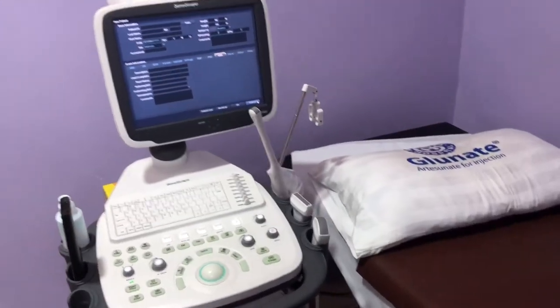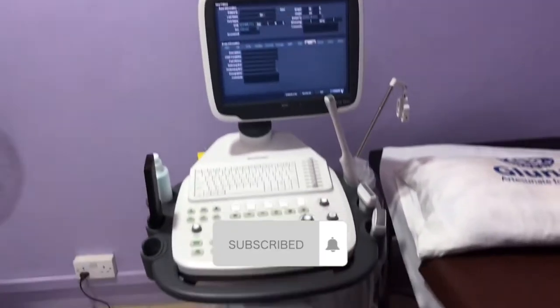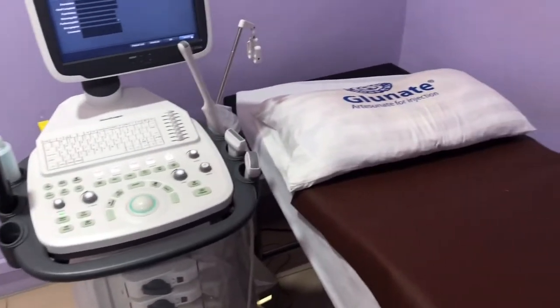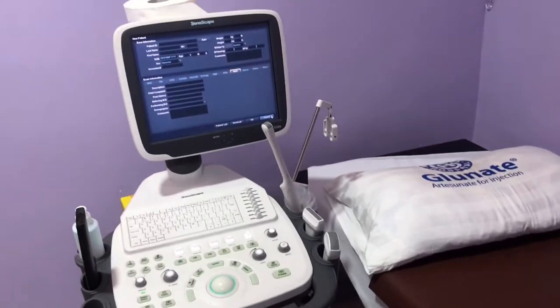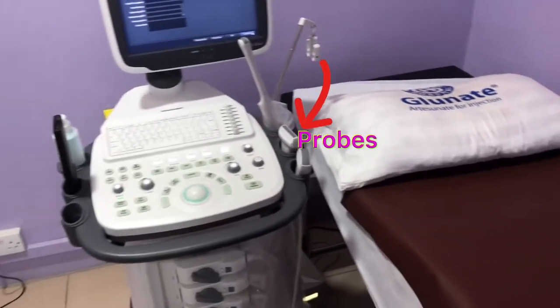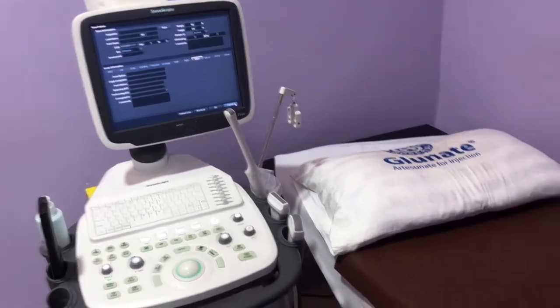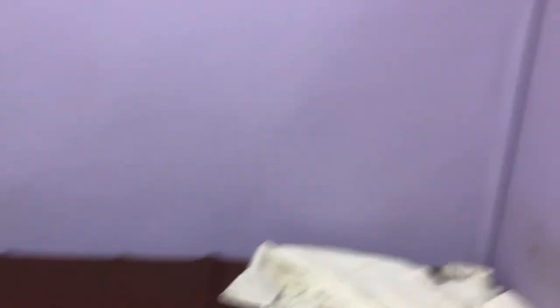This is the ultrasound machine with its knobs and the monitor, and that is a patient's couch or bed right beside it. As you can see, there are some ultrasound probes by the machine, and then an acoustic gel in the bottle — that's basically the gel you apply on the patient.